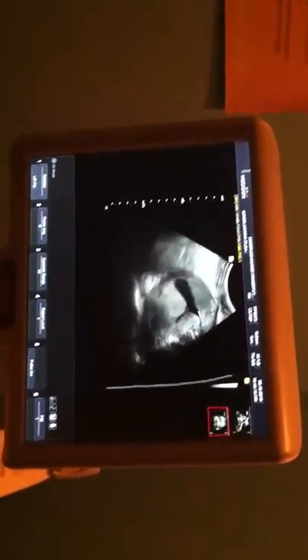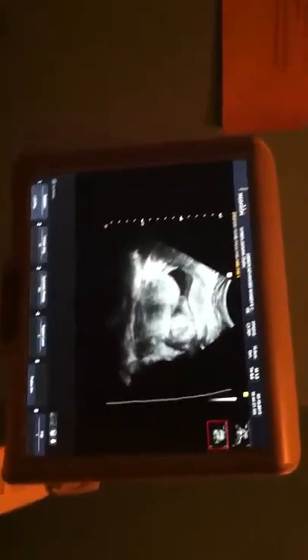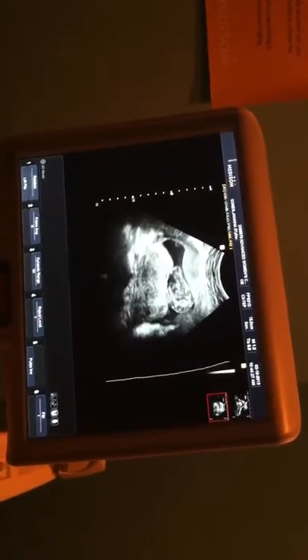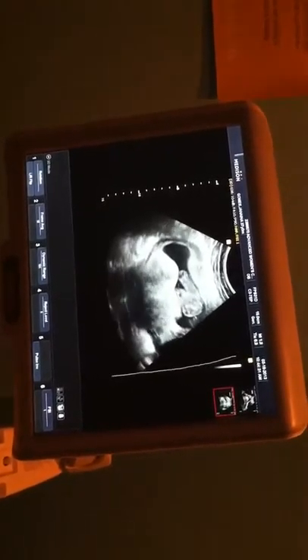It's not laying in a good spot. This is just pieces and parts — this is just placenta here. I think you've got a placenta there, a little piece right there, so I'm just trying to get a better picture of that.